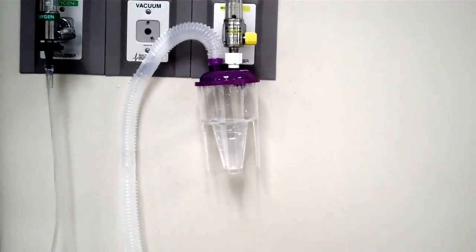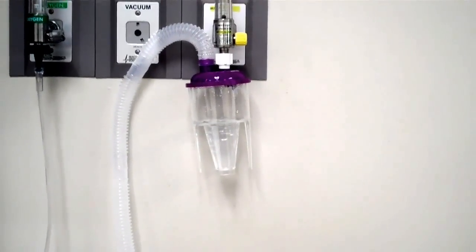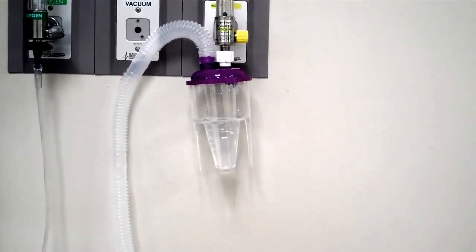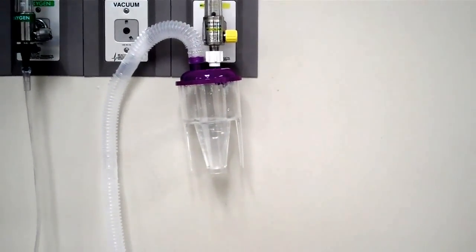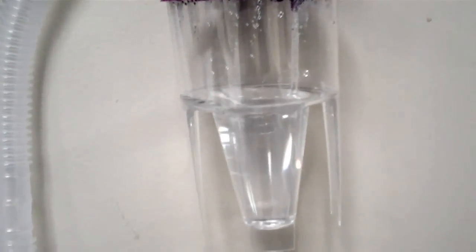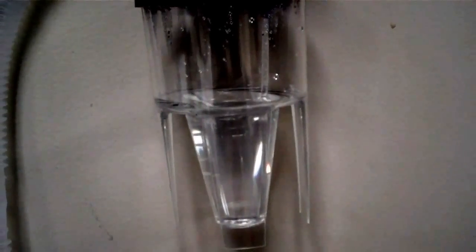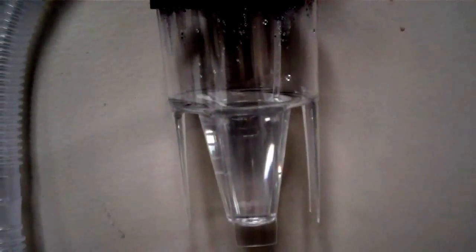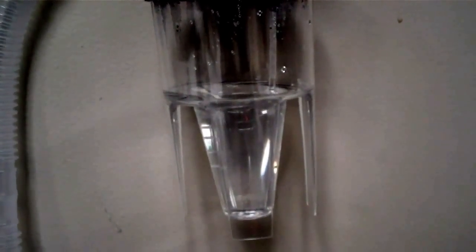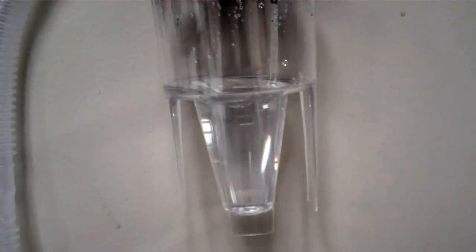We've seen the small volume nebulizer, then we saw the breath actuated nebulizer. Now you're looking at the large heart nebulizer. If you look closely you'll notice that this has the ability of containing a large volume of liquid. This is going to be your normal saline for inhalation and also your bronchodilator.